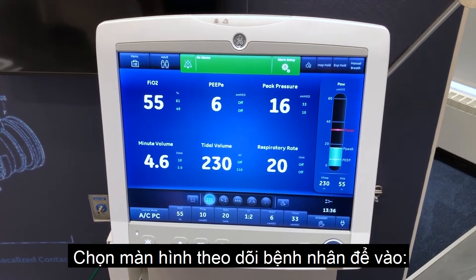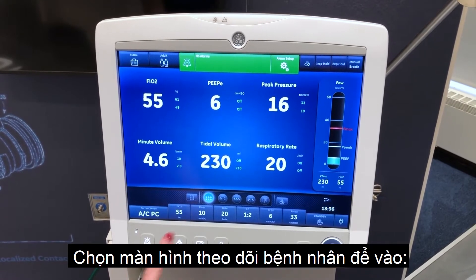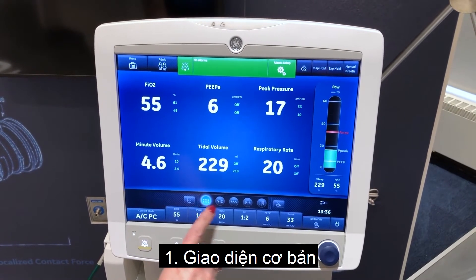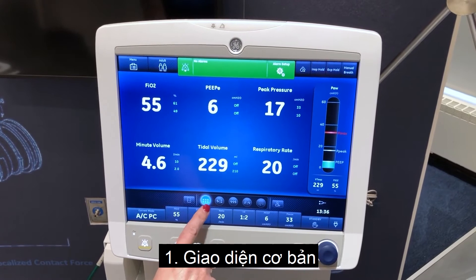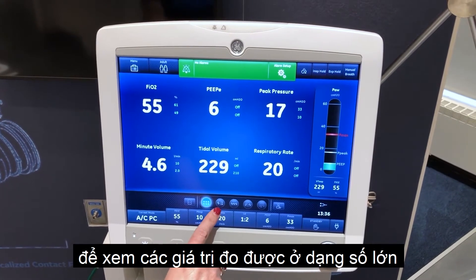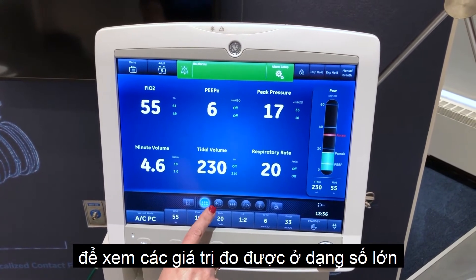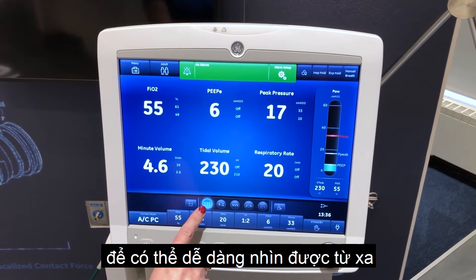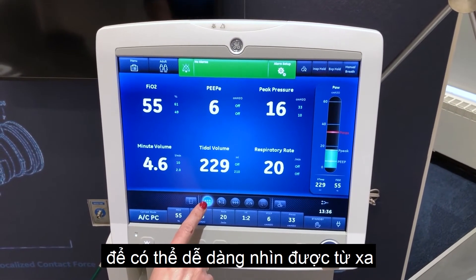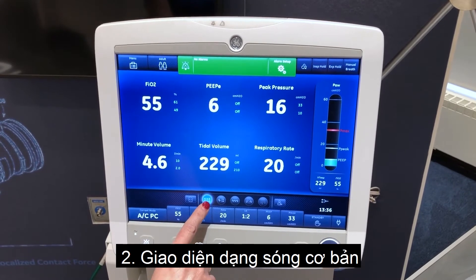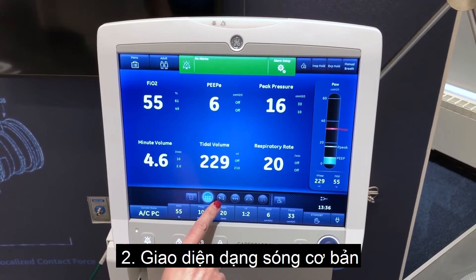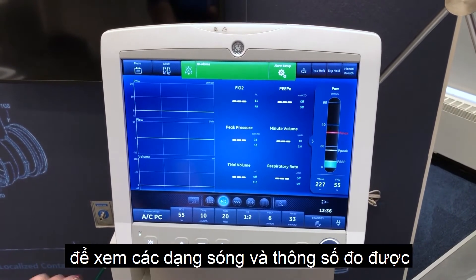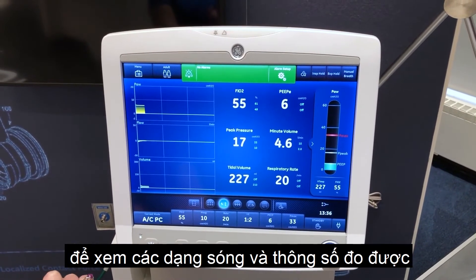Select the patient status workspace for access to basic view to see measured data in a large format that can be easily viewed from a distance. The basic waveform view to see patient waveforms and measured data.